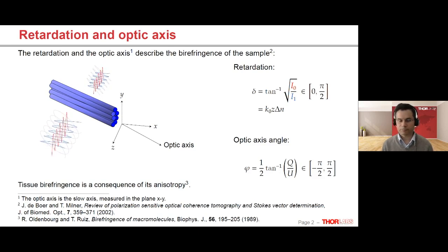Okay, and the last one is more a response to a question on how to extract the information of different layers in retardation images based on a threshold of the intensity. The response is that the local retardation difference, not the accumulated retardation, can be used to show birefringence layers, which is just the same as the slope of the accumulated retardation, just as the speaker said.